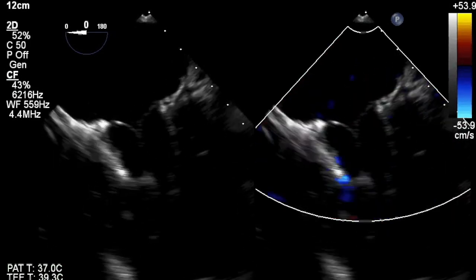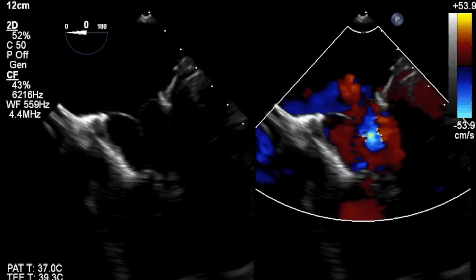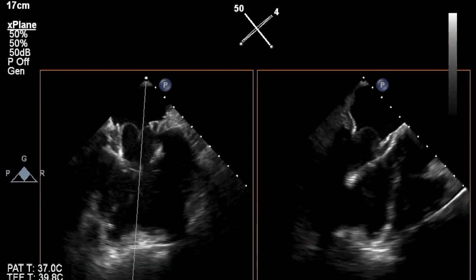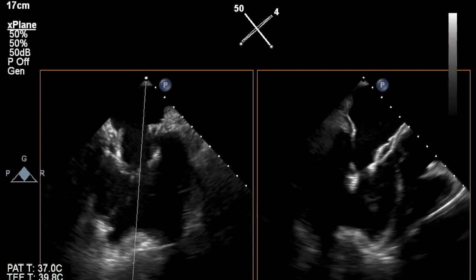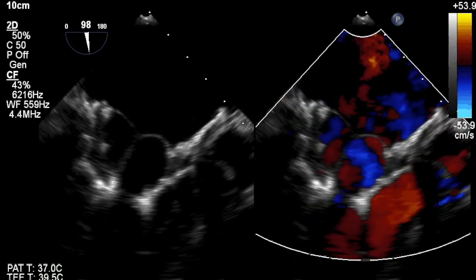Tether tension is checked hemodynamically and visually, echocardiographically. A pigtail catheter is usually used to evaluate the LVOT gradients and measure LVEDP, and the amount of tension to the LV apex is measured via a device. You can visualize the apical indentation due to the tension. This is to assure the valve does not change its position and lead to paravalvular leak.